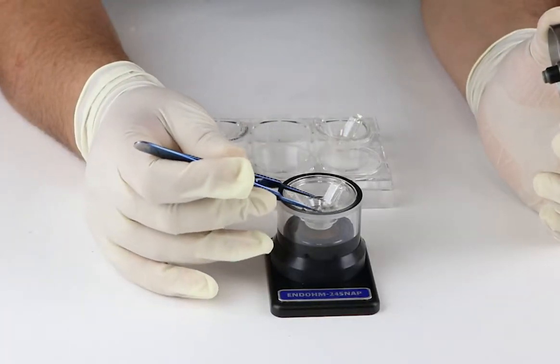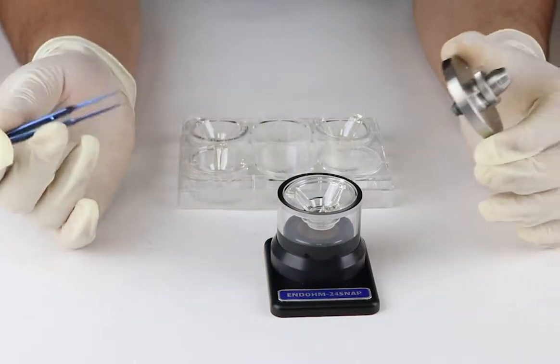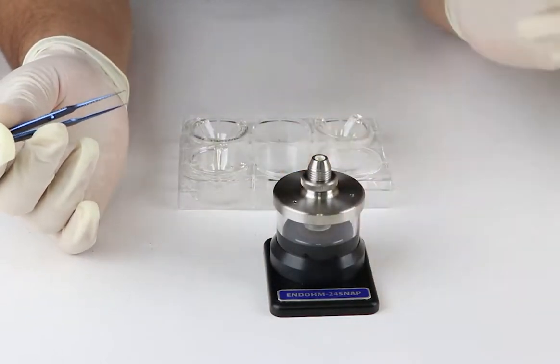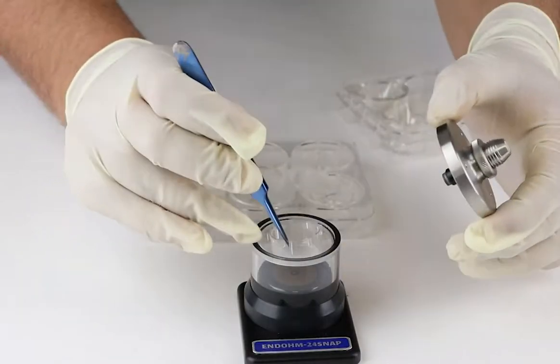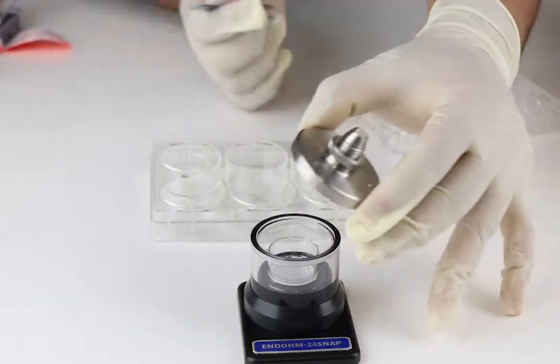Cell culture inserts which stay hung in the well plate are known as hanging inserts. The standing inserts stand in the well of the well plate.